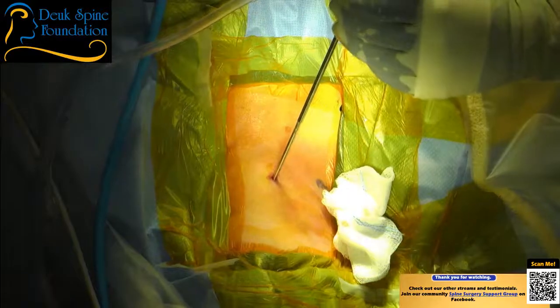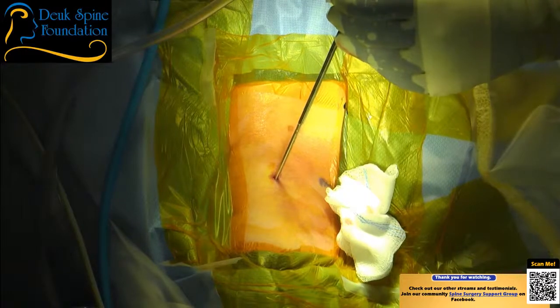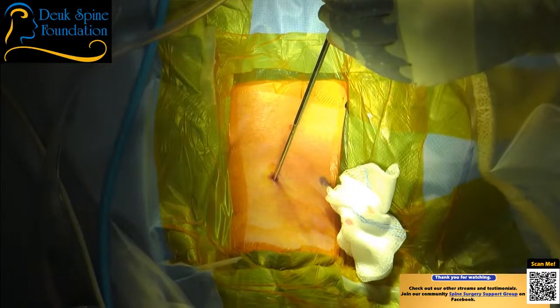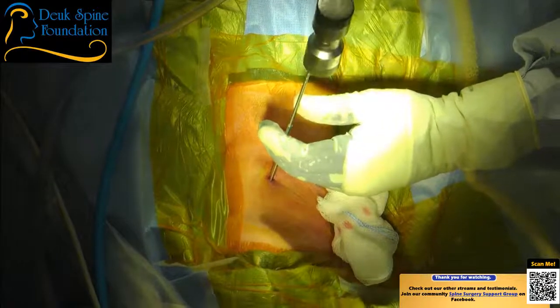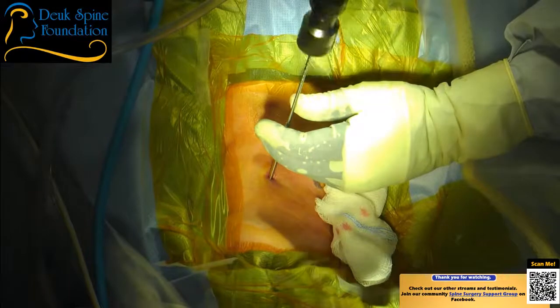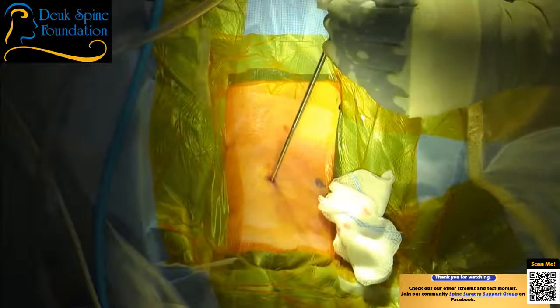All right, so we're going to advance the tubular retractor down into the disc space. Right now the tube is at the front of the disc, and I'm going to bring it down. While I'm doing that, I want to make sure the dilator doesn't pull back or go forward. Right now it pulled back a little bit. So I need to advance it again.